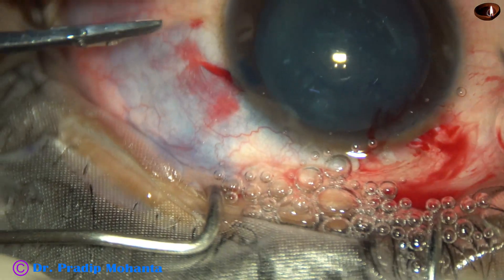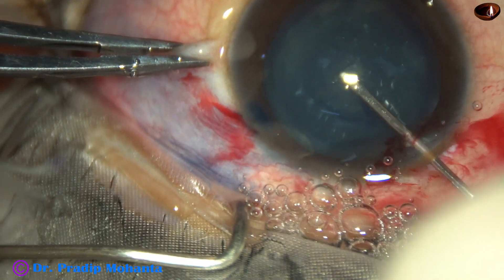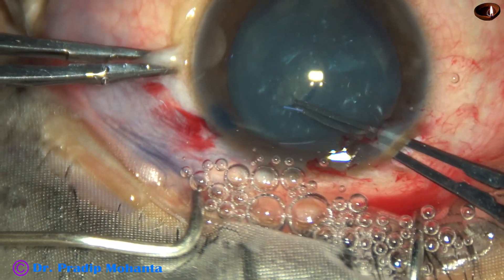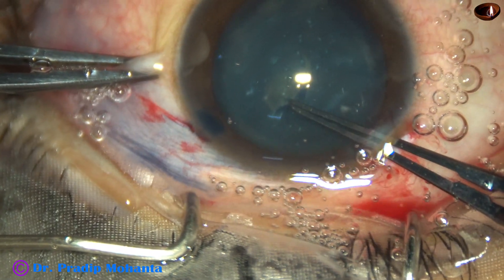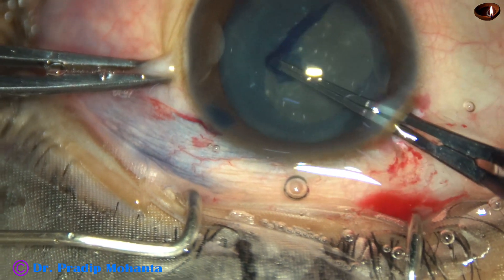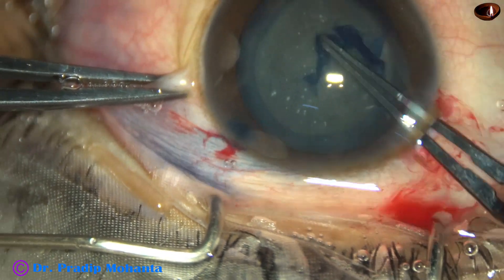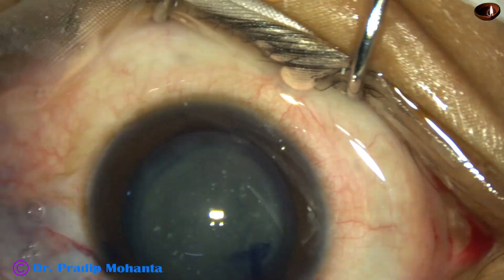After making the incisions and staining the anterior capsule with Trypan Blue Dye, a capsular tag is raised with a 26-gauge bent needle, and then utrata forceps is used to do a continuous curvilinear capsulorexis. The size of the rexis should be not less than 5.5 mm because capsular phimosis is not uncommon in younger children.